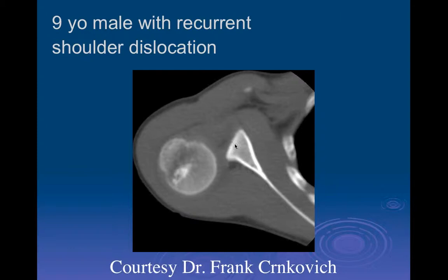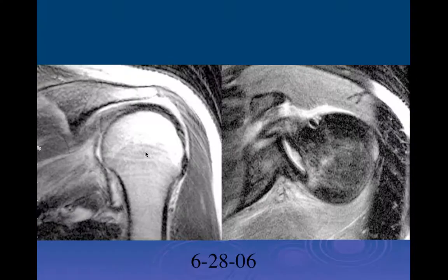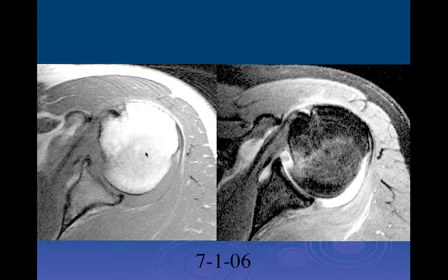Now, look at the glenoid here, and what do you see in the glenoid that might be a predisposing factor to posterior instability? There's laxity. There is a laxity of the capsule, the capsule looks pretty lax. Okay, but what we're seeing here is abnormal retroversion of the glenoid, like we talked about in the last couple of lectures. If the posterior part of the glenoid is not well developed, or if it's just angled too much posteriorly, then you have increased risk for posterior instability, as we talked about in the previous lectures, and that's the case here.